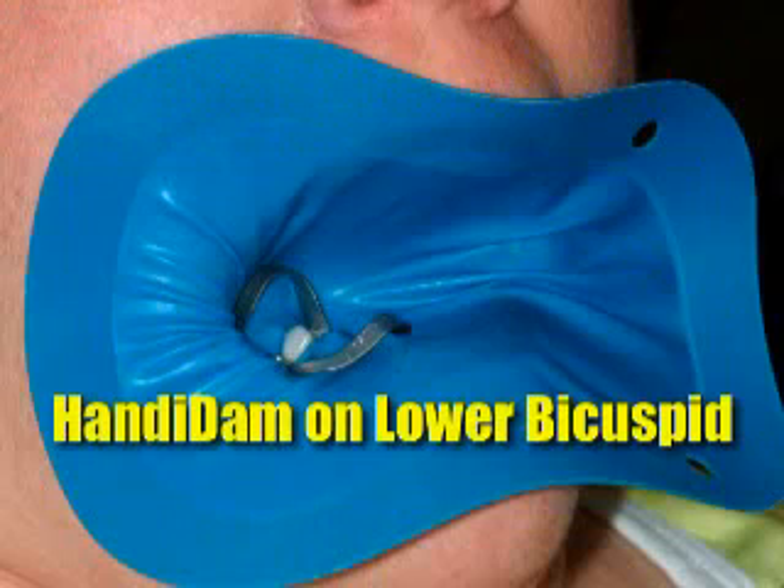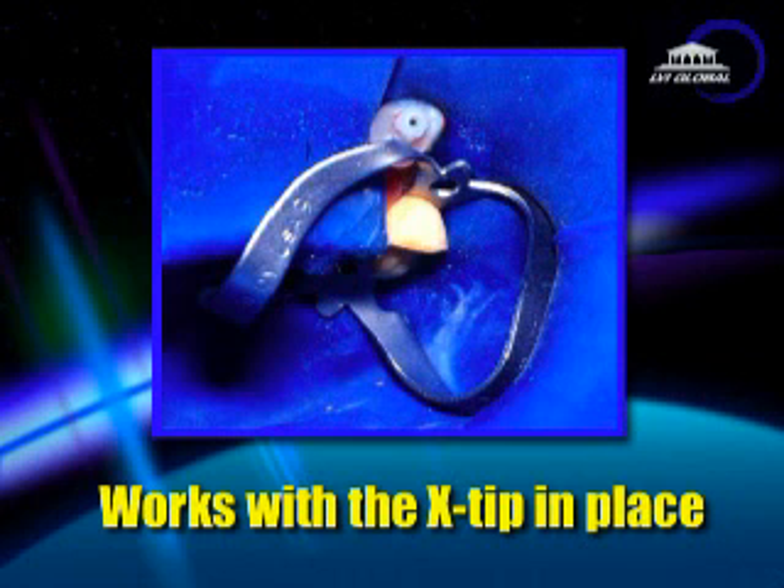Here's a photograph of the number 9 placed on a bicuspid. The Handy Dam is a great rubber dam that does not require an extra frame — the frame is built right in it — and you can get the Handy Dam both in latex and in non-latex. One more thing.